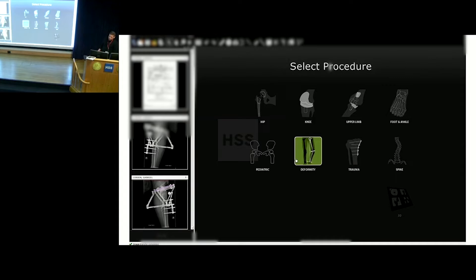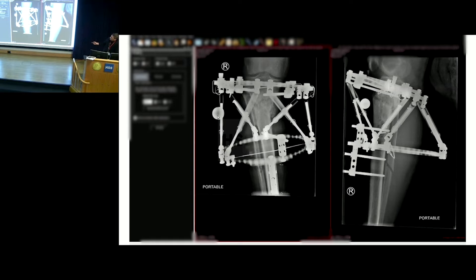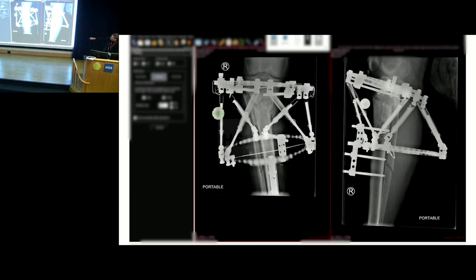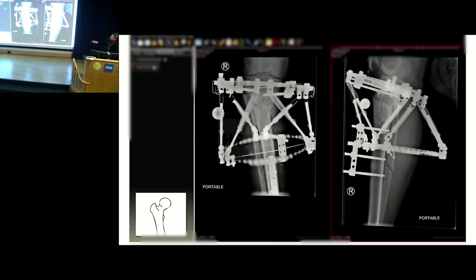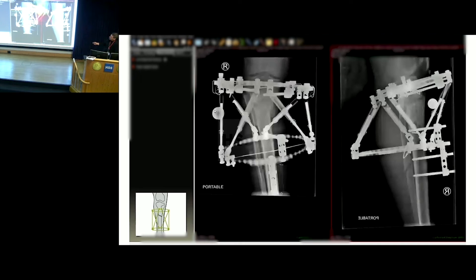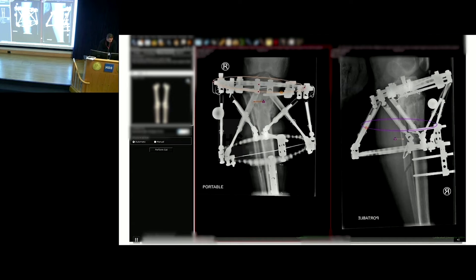This is the module in TraumaCad. These are x-rays I take in the OR — I tell the tech exactly where to angle the beam to superimpose the top ring. They're calibrated. This is a Smith & Nephew TSF; the calibration markers come in the kit, and TraumaCad has a TSF module. So we're calibrating the images. TraumaCad has a Taylor Spatial Frame module — it wants us to flip the image just for orientation. This is how I plan the TSF.